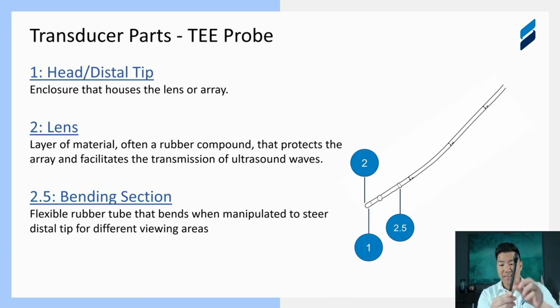So is that vulnerable to damage? Absolutely, and so is the lens, especially to lacerations from surgical equipment and some accidental bites from a patient. Anything jagged or sharp can lacerate or put a micropuncture in these areas.